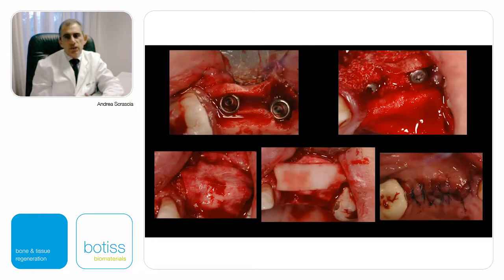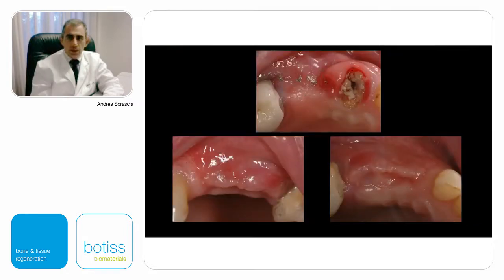I made an insertion after extraction, while on 2.5, where we had an extremely thin bone, I executed a split crest technique, filling the remaining bone defects with heterologous bone and a resorbable membrane. And to augment the volume, I added the Mucoderm membrane. We can now notice the increase of soft tissue volume and the anatomical shape changes of the edentulous area.